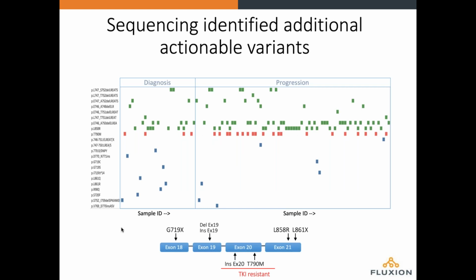Now, the power of sequencing, of course, is to be able to detect additional variants that are clinically important but aren't covered in narrow PCR panels. What you see here is a focus on a particular class of variants that are known to be important for TKI sensitivity or resistance. This type of therapy is administered where patients have either a DELEX19 variant or L858R. Those are called sensitizing variants, and this cancer center would administer it whether these were found in either tissue or blood via this assay.